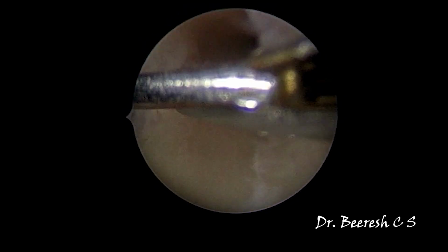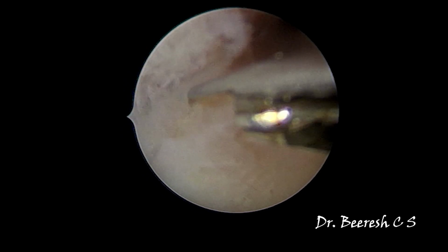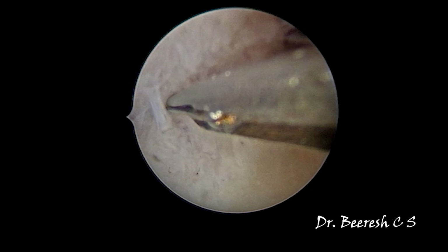So the lateral metroplasty on the right side is also being completed.